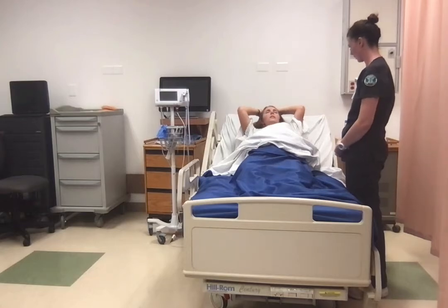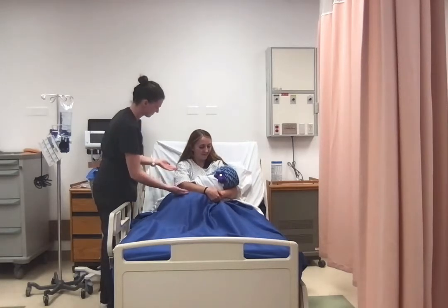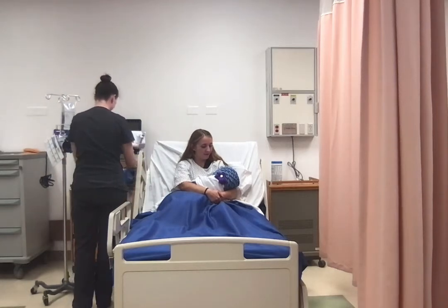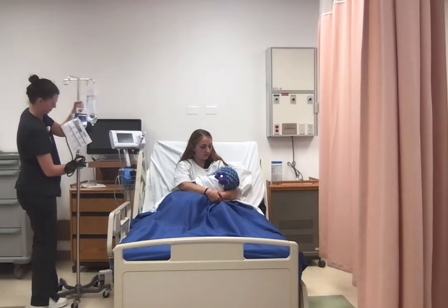Okay, thank you. Okay. Nurse Lake called the doctor, and as the doctor arrived, Rebecca was ready and dilated to 10 and ready to push. Fetal heart rate remained moderate with variability and was absent of decels, making this birth category 1 throughout labor and delivery.